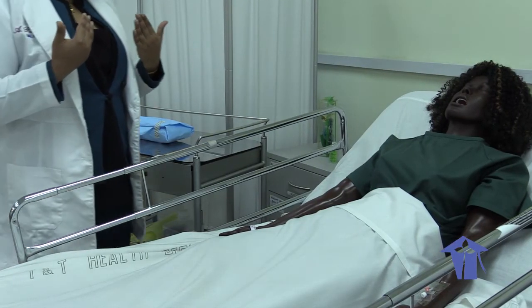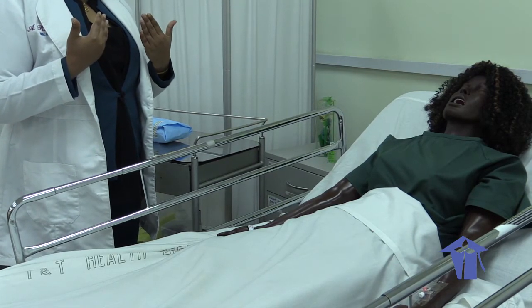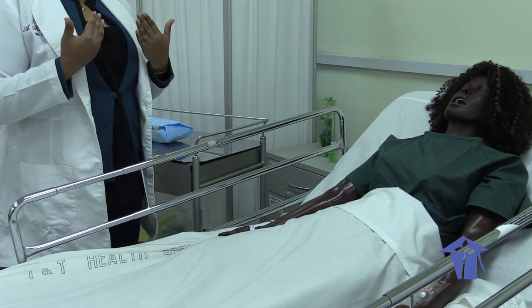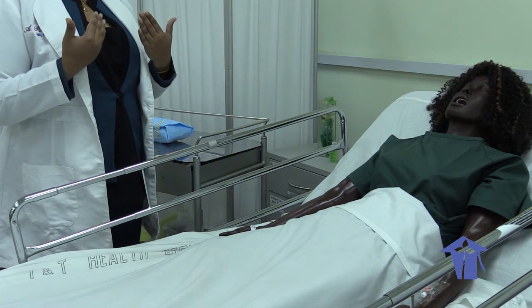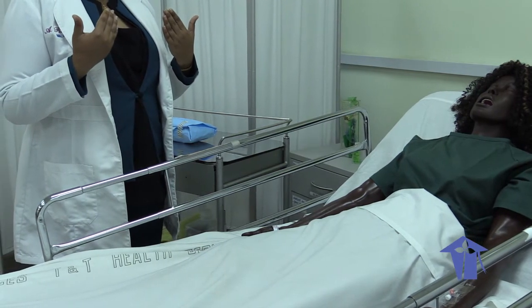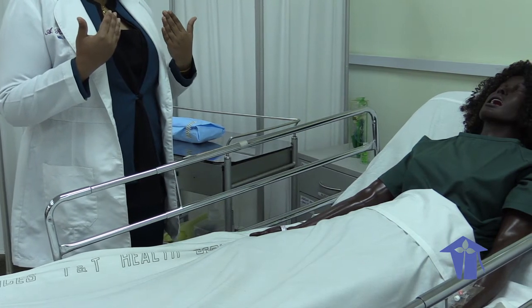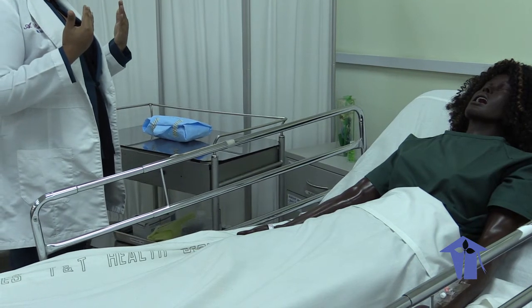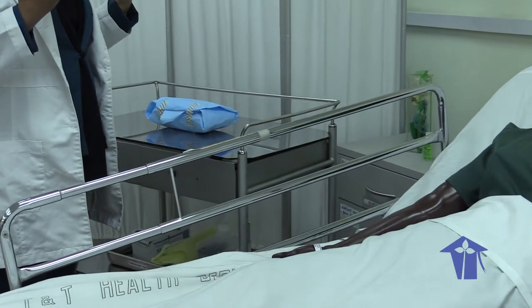Okay, Miss Williams, I have returned to continue your wound procedure. Before you enter the room, remember to perform your surgical hand washing. When you enter the room, remember to position your items in a triangle. Your dressing trolley should be placed in front of you. The patient will be at the side and your bin at the foot of the bed.